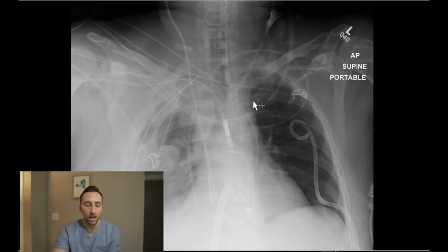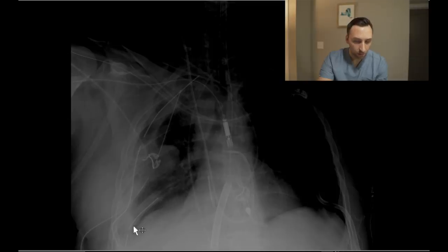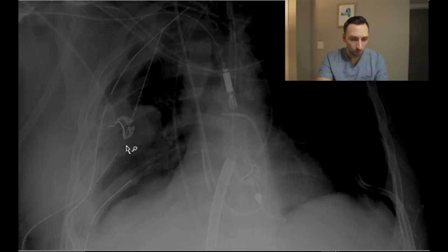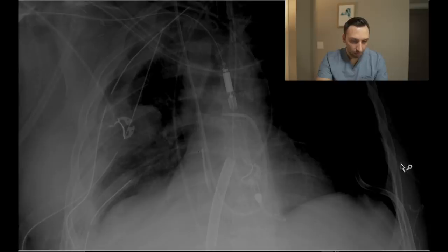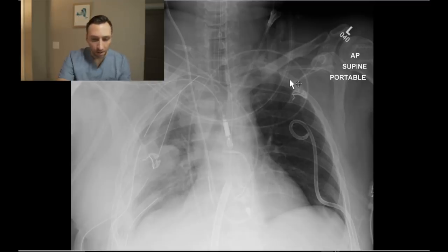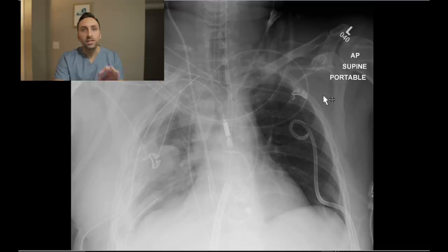Now that we've got the lines, tubes, airway, and esophagus out of the way, let's go to the lungs. Over on the right hemithorax we have not one, not two, but three chest tubes — one, two, three — with their respective side ports. On the left you'll notice the left pleural pigtail catheter as well, and I think that about concludes all the lines and tubes in this patient.